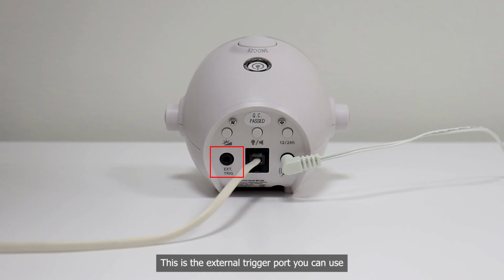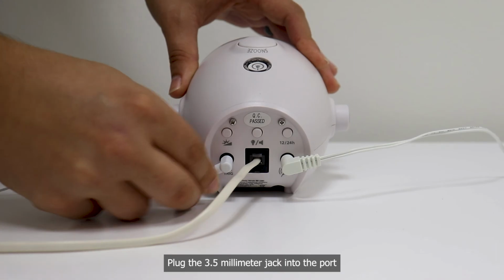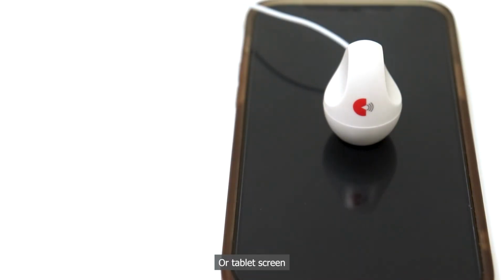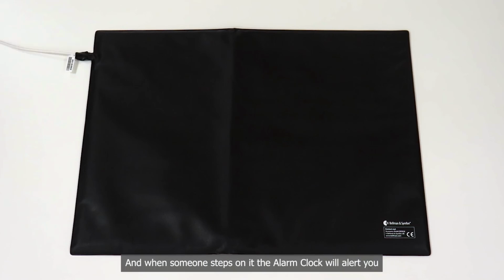This is the external trigger port you can use for different accessories. You can use the mobile phone sensor. Plug the 3.5mm jack into the port. Then put the mobile phone sensor on top of your cell phone screen or tablet screen. If you receive a call or other notification, the alarm clock will alert you. Or you can use the contact mat. Place the contact mat next to your bed, and when someone steps on it, the alarm clock will alert you.